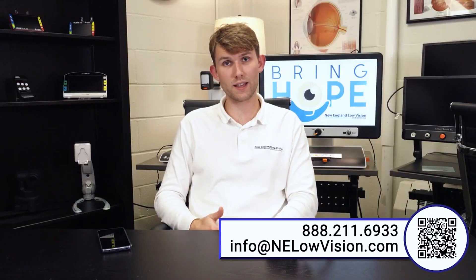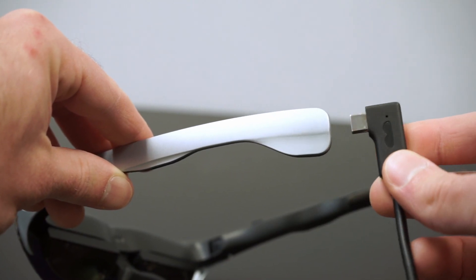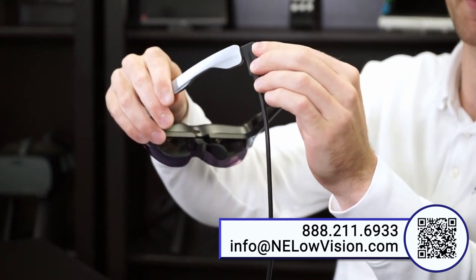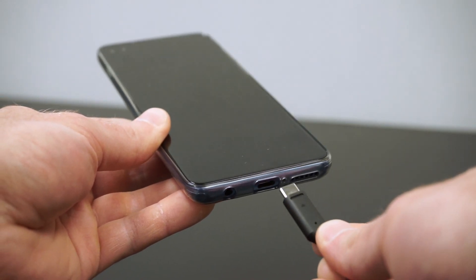The device utilizes a USB-C connection that connects to the back of the glasses, then into the port on the phone. Snap that in and it's very secure — there's no risk of it coming out or being dislodged in any way. Plugging it into the phone is just like how you would plug your charger in, right on the bottom.